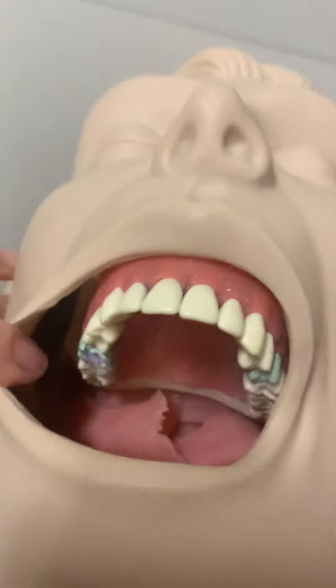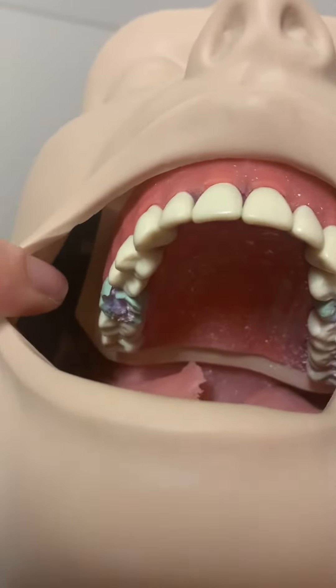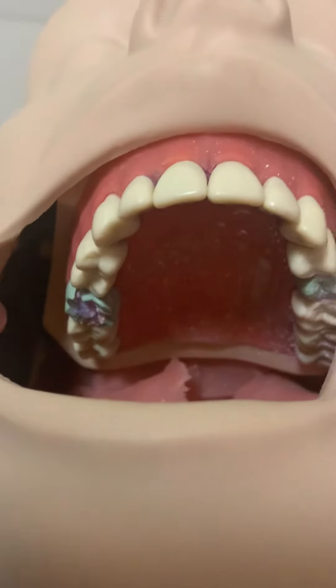We're going to be working on tooth number three. So we want to do some moisture control to keep that area nice and dry.